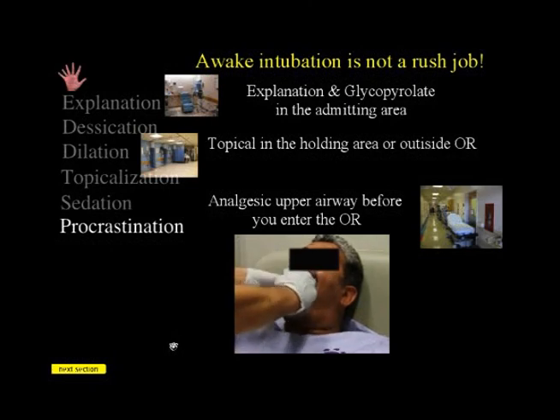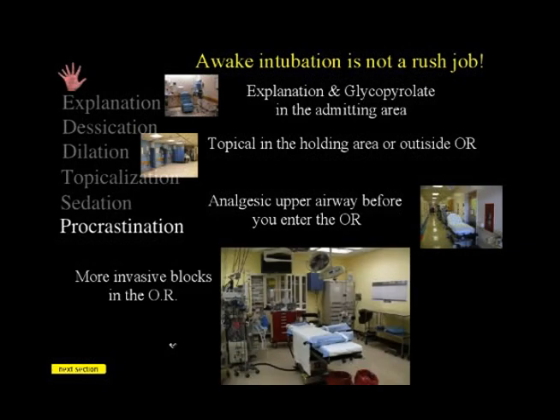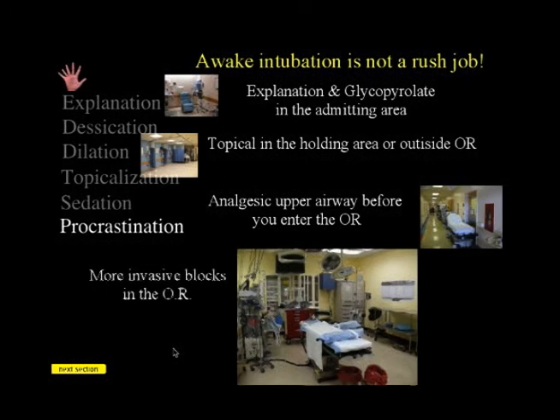Oral airway at least 2/3 of the way in the mouth before I will let them go through the door into the operating room. This is showing him, we're actually still in the holding area here, and he's tolerating the oral airway. If I'm doing invasive blocks, we didn't talk about invasive blocks today, but if someone insists on using needles, I'll do that in the operating room with good monitoring.